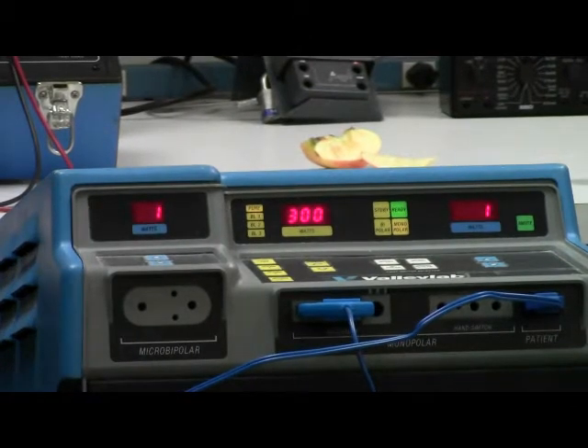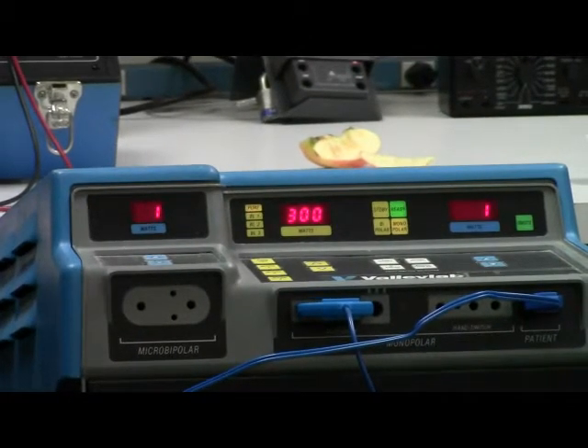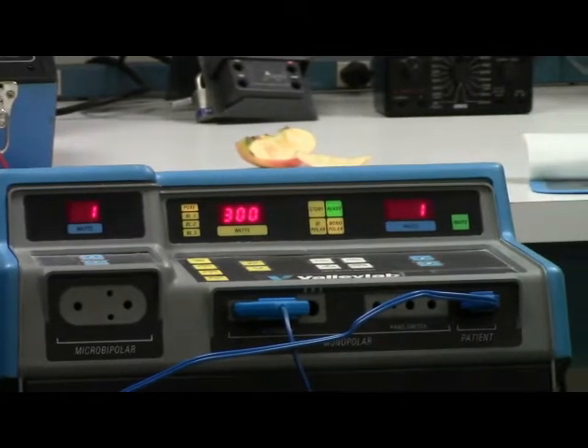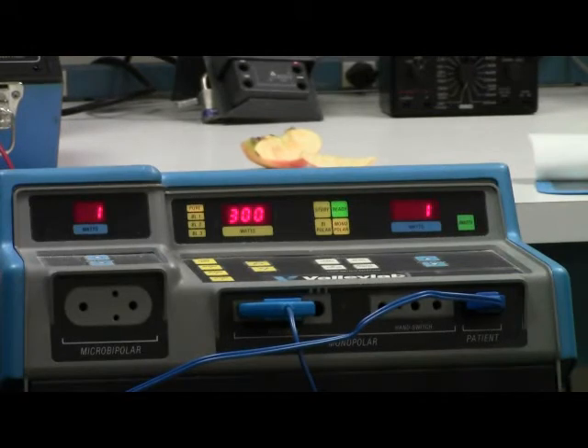On the other side of the unit is the coag setting, and there are no blend settings or presets — it's just a manual up and down, with a maximum of 120 watts.